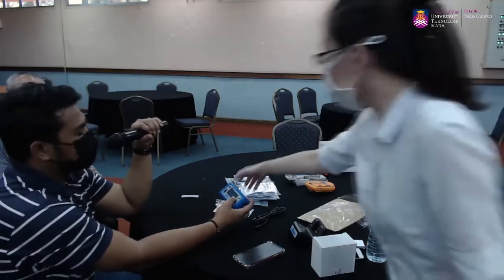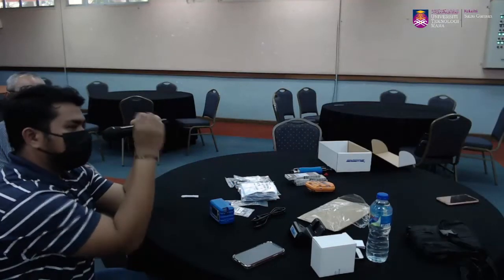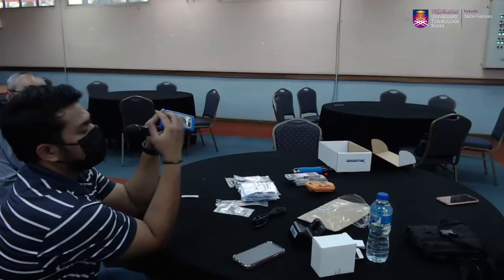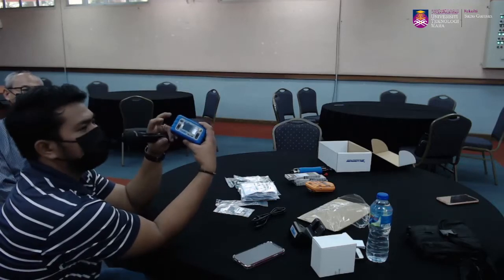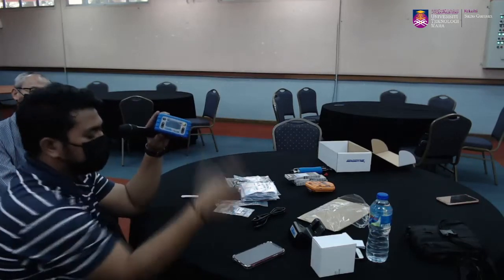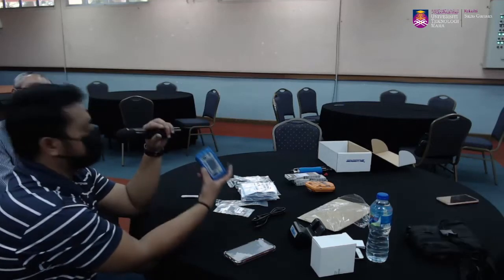Tapi usually kalau you press up and down, tengok kalau dia ada flash keluar dia punya reading, dan okey lah. Kalau you tak tekan up and down pun still akan ada tulis bacaan dekat sini. Sebab sometimes dia nak jimatkan bateri, sebab pump pun dah pakai bateri, and then dia punya digital parts lagi, so nak jimat bateri, dia ada macam rest mode lah. Macam phone kita biar idle, tak perasan, betul, yes.